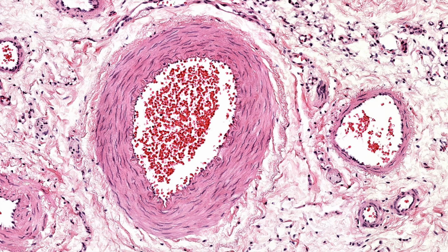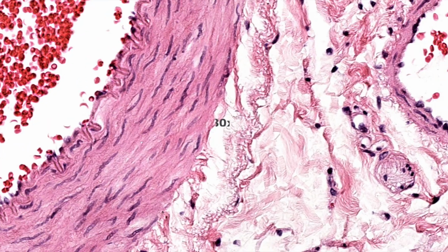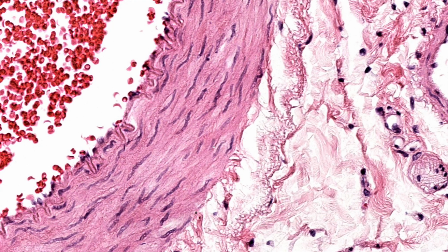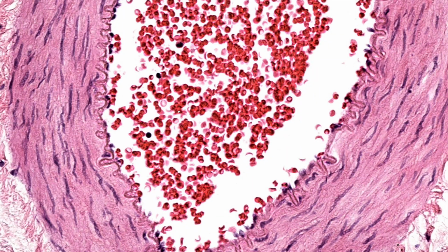I just noticed it and I thought it was pretty. And hey, I'm gonna show you something. Can you guys see this funny, weird, geometric pattern in the background, or am I hallucinating that? Maybe it doesn't come through because it's too small. Okay, maybe it's a hallucination also.